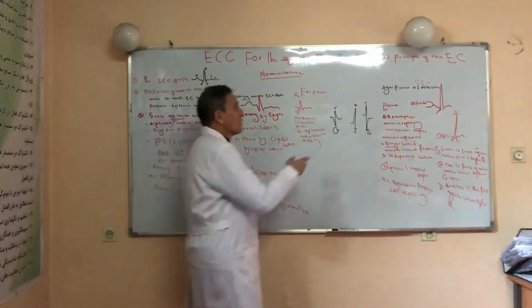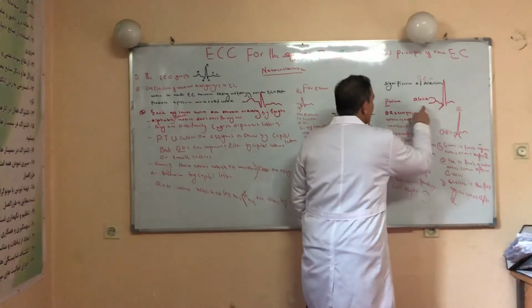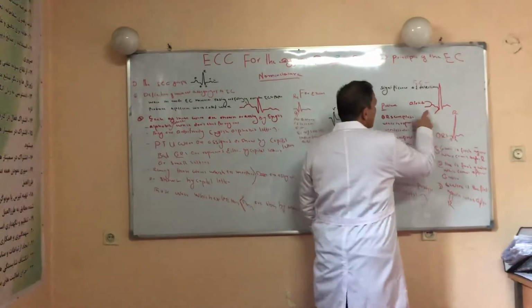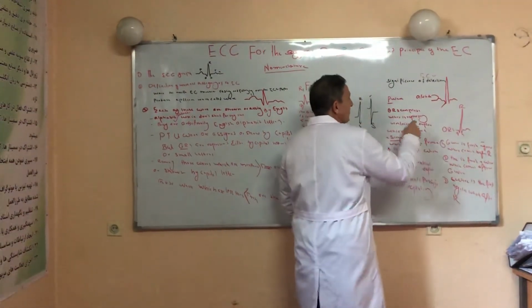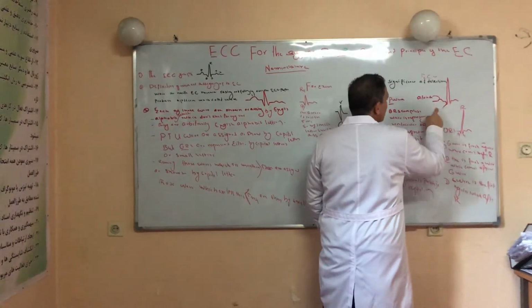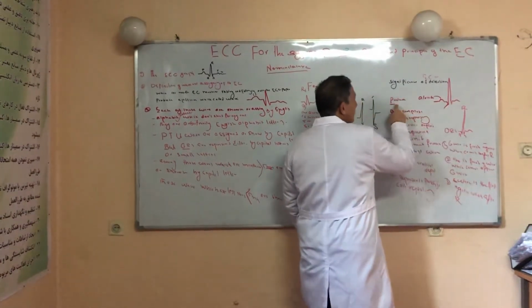Now we will be discussing the significance of ECG deflections. The first wave of the ECG is called the P wave. This P wave represents atrial depolarization. It is the first wave, a round, positive wave produced with moderate conduction.